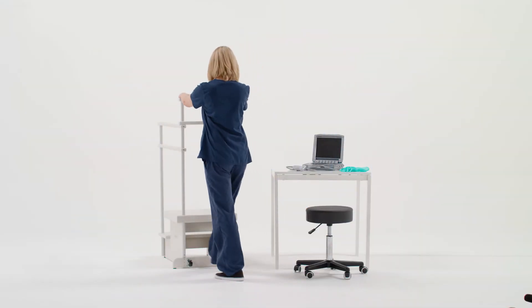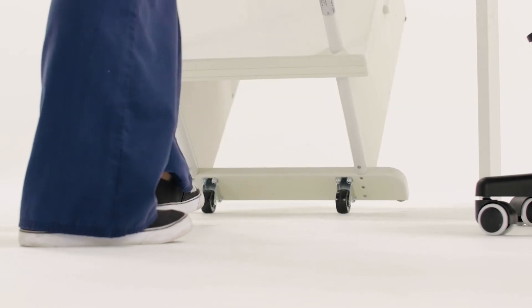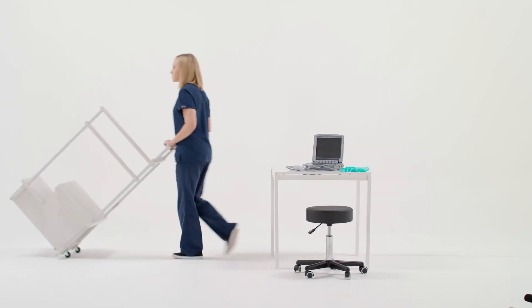And for added versatility, the tip and toe feature makes moving your step from room to room and into storage nearly effortless.